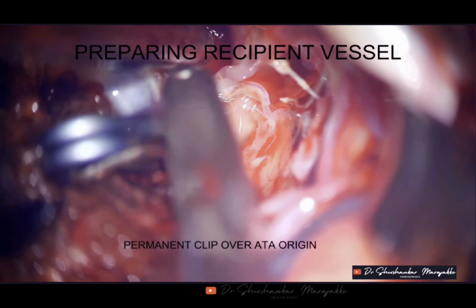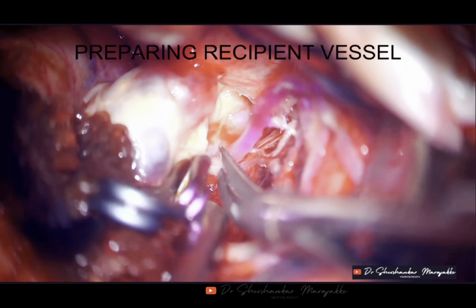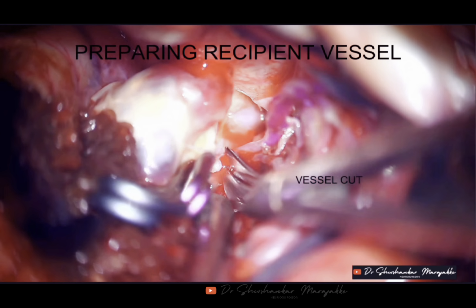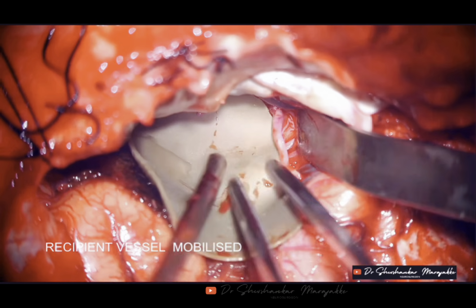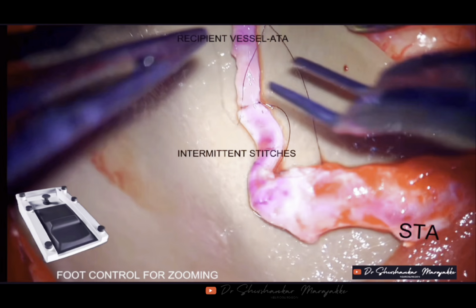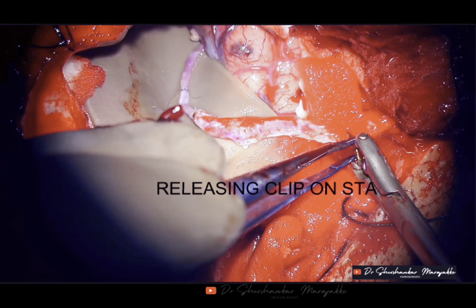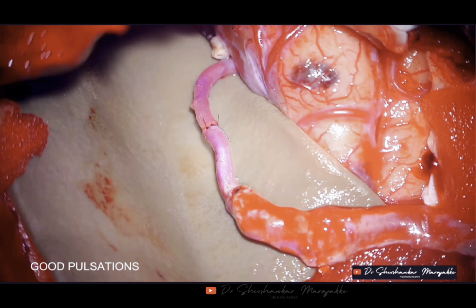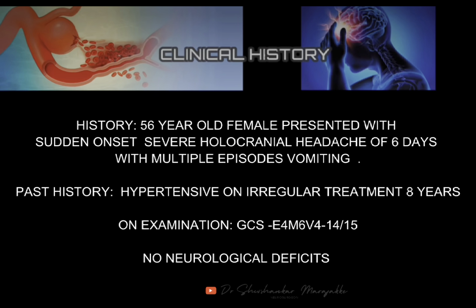So we went ahead with an STA-MCA bypass in this case. The anterior temporal artery was divided and brought up in the sylvian fissure, and anastomosis with STA in an end-to-end fashion was done. You can see this was an unplanned bypass, but it can be executed if we know the skill of bypass. Here you can see the successful end-to-end anastomosis in this case.